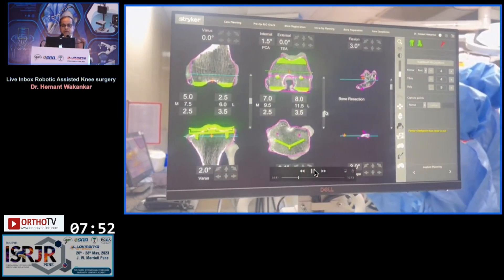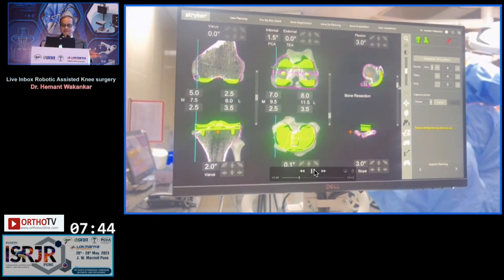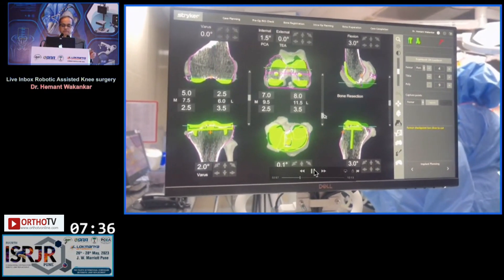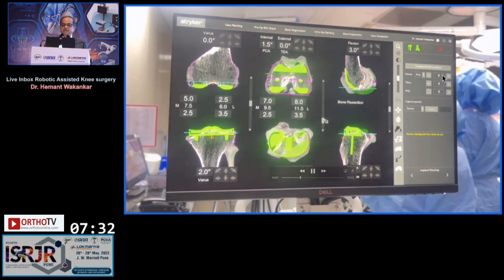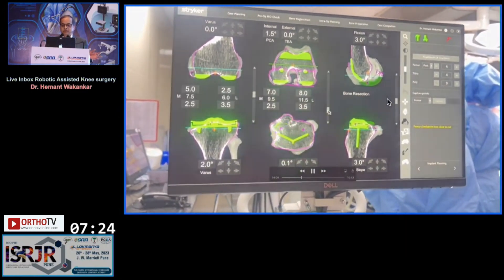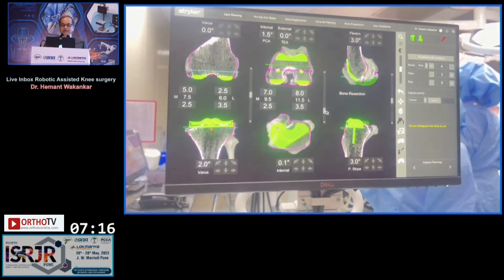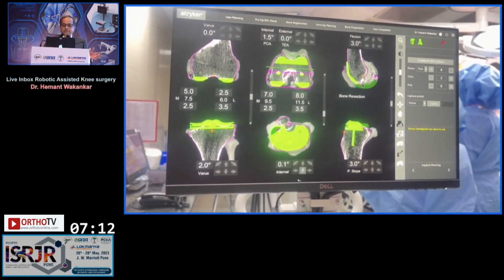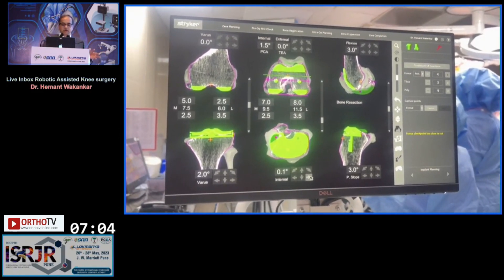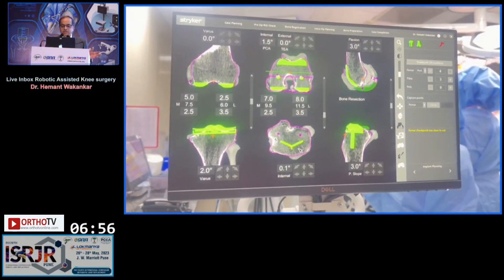I check my trochlea. Trochlear matching is important because it is shape matching, especially important in MAKO — that is the beauty of the CT-based system. I make sure it is not overhanging medially or laterally, and similarly the posterior condyles have to be matching. On the tibial side, femur size is 4 and tibial size is 4. With size 4 tibia I don't have much scope for reduction osteotomy, so I will downsize tibia to 3. I then lateralize my tibial baseplate and see how much bone I have on the medial side — and I can see there is significant bone I can resect medially, which will give me my medial-lateral balancing. By doing this, I get my balancing perfect.